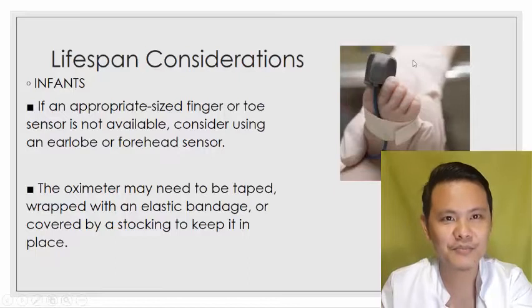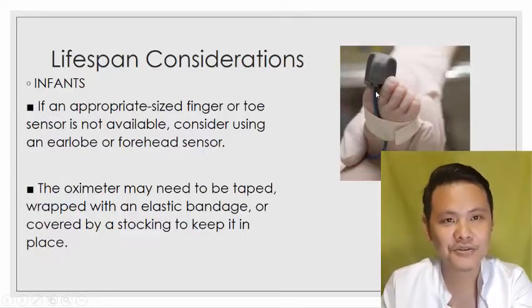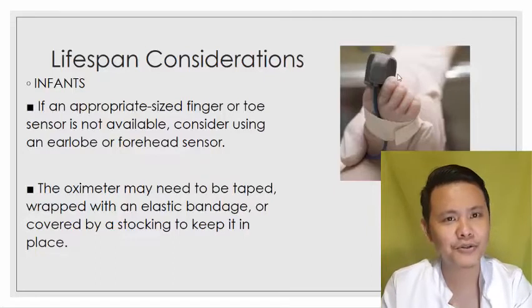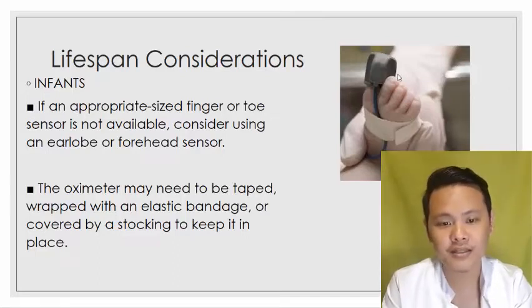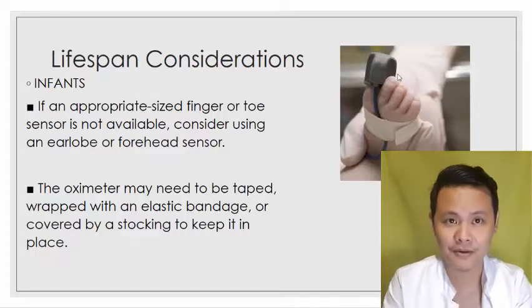Okay? Ang ginamit po rito na probe is, ayan, for pedia, nilagay dun sa kanyang big toe. Ayan. So, we have to consider the appropriate size of the finger or toe para sa mga pasyente natin. What else? The oximeter may need to be taped or wrapped with an elastic bandage. Nang sa ganun, hindi po matatanggal, lalo na sa mga pedya, sa mga makukulit.